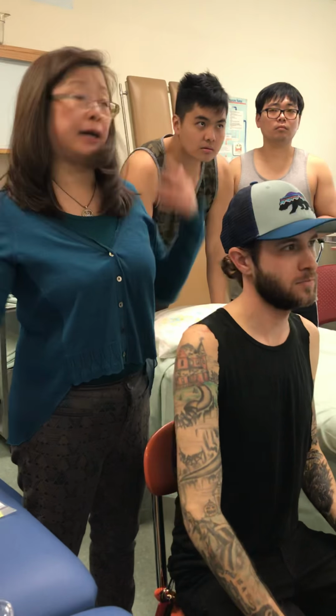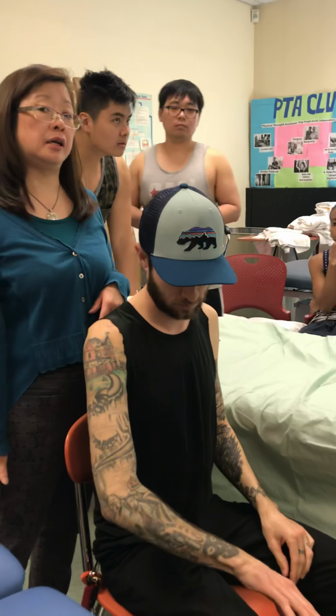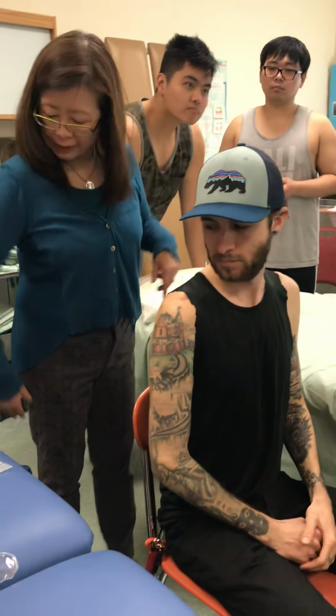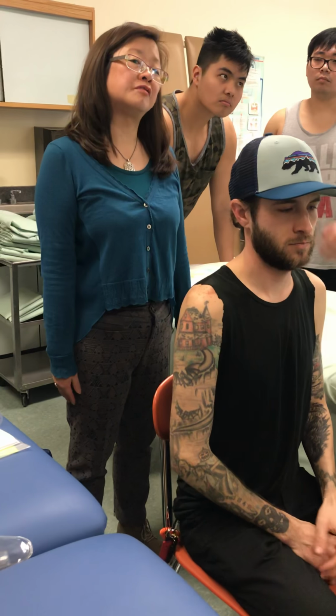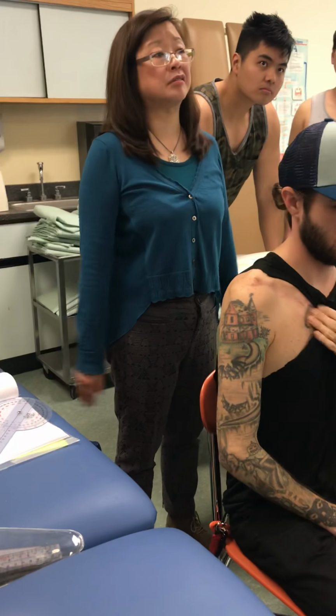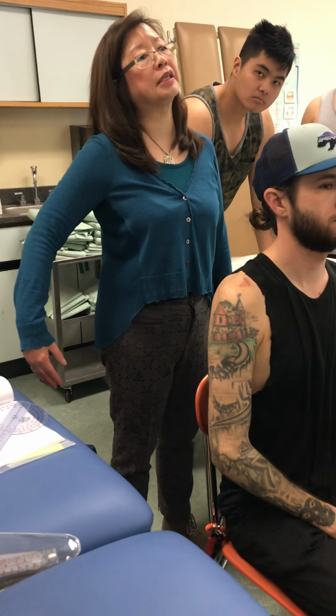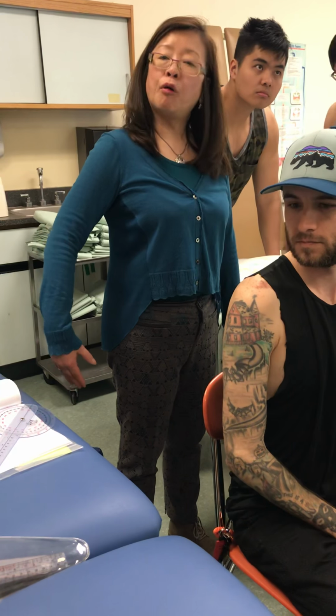Lower his arm to the side. Lower it down. Okay? Or bring your arm to the side. Alrighty? Now, most people will have 0 degrees of abduction. Most people do. Very rarely will you see this arm out here. If it is, alrighty?